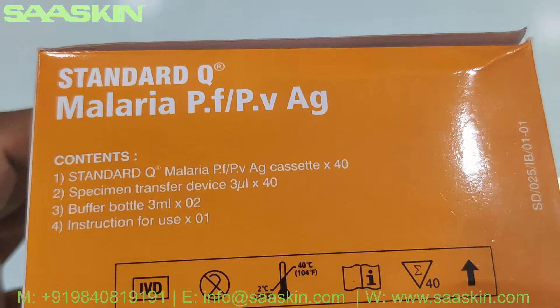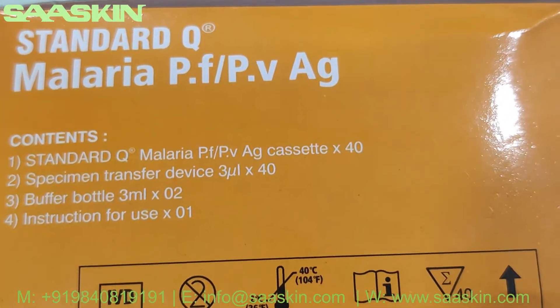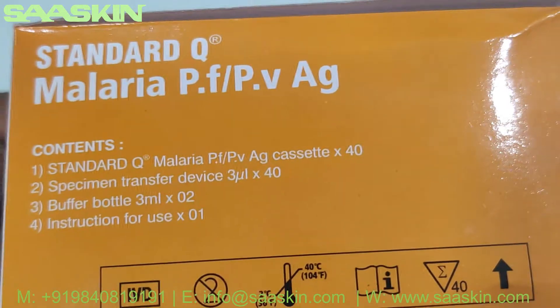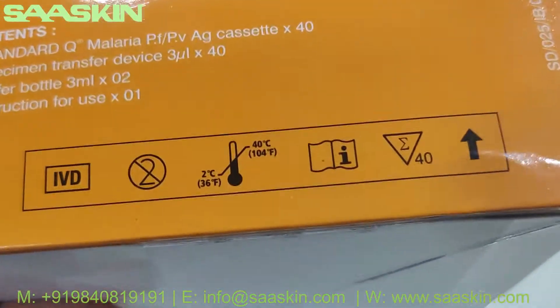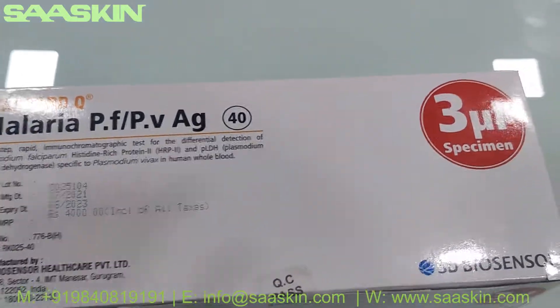The box shows the contents inside. It contains the Standard Q Malaria PF-PV antigen cassette — 40 units — and specimen transfer device 40, buffer bottle 3ml (2 bottles), and an instruction for use. This is an IVD-certified product.